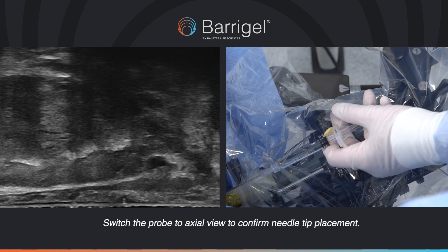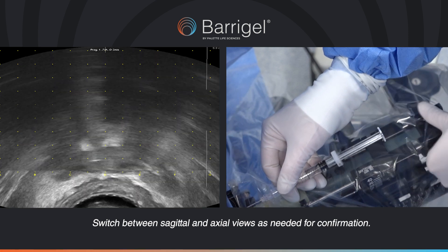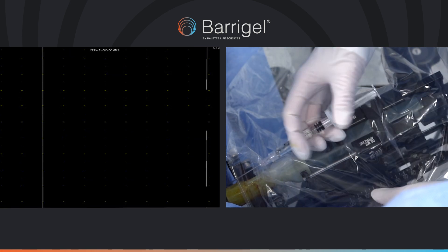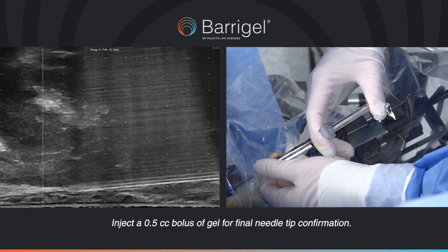Switch the probe to axial view to confirm needle tip placement. Switch between sagittal and axial as needed for confirmation. Inject a 0.5 cc bolus of gel for final needle tip confirmation.